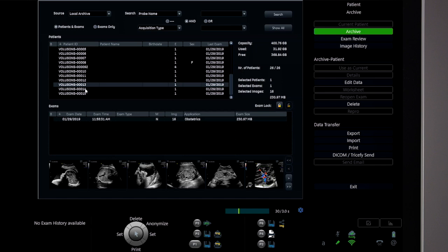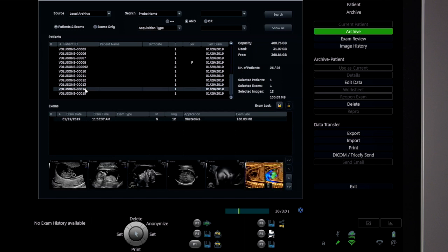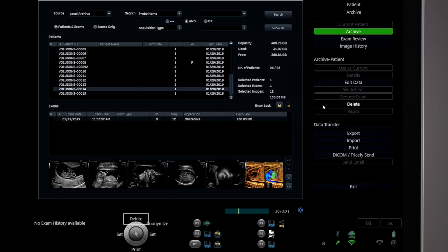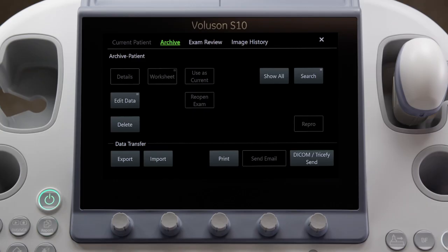To delete studies, select a patient from the archive list, then select Delete from the display menu, from the top trackball key, or by using the touch panel.